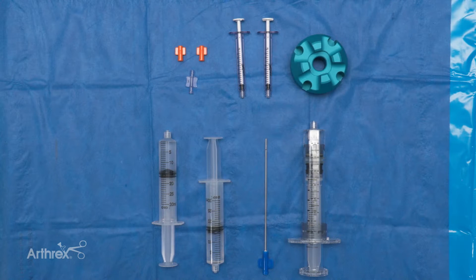Hey everyone, Dr. Michael Barria here. I'm the director of Orthobiologics at The Ohio State University and we are reviewing our technique for adipose processing using the Adipose device. To this point we have completed our infiltration of all of our tumescent fluid and that has sat for 20 minutes and now we are ready to begin the adipose harvest.